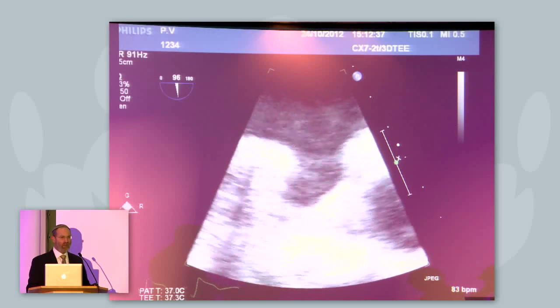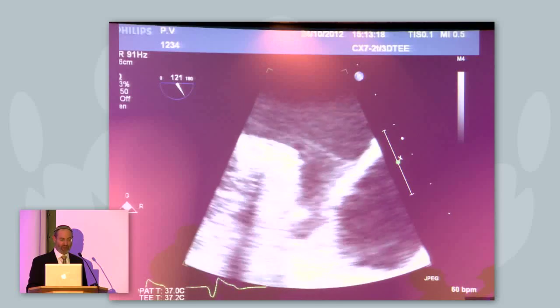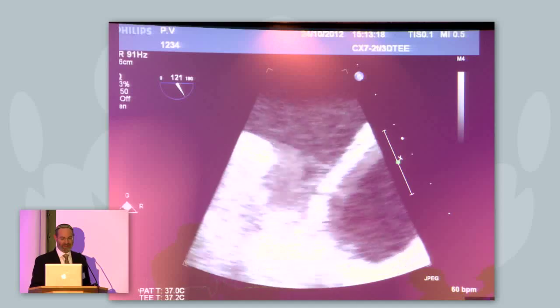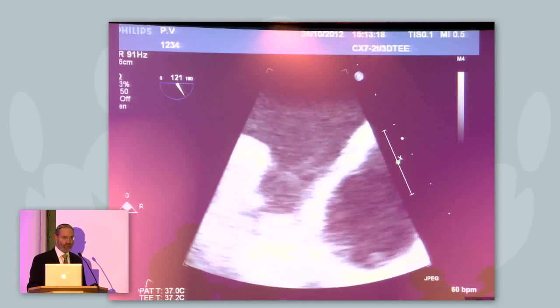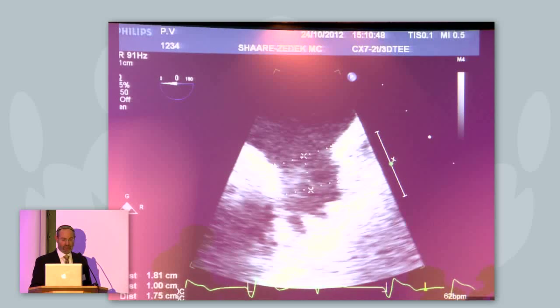Once again, do a complete scan so that you can understand, and finally come across to the 120 view, which is not useful particularly for measuring or for deploying, but nonetheless it allows you to see some of the distal lobes and where they are and how complex the appendage is. Then you're going to come back and you'll do your measures, and here you can see a relatively straightforward measure where we would measure our ostium and where we would measure our landing zone 1 centimetre in.